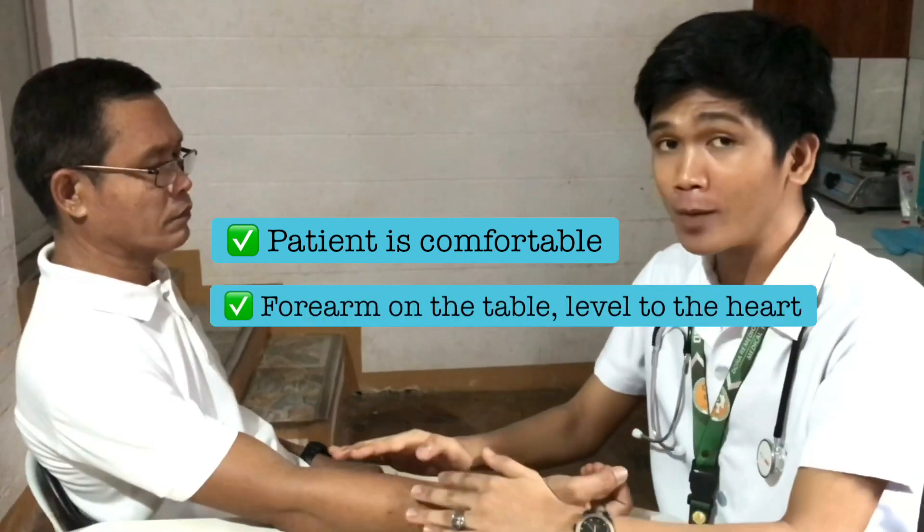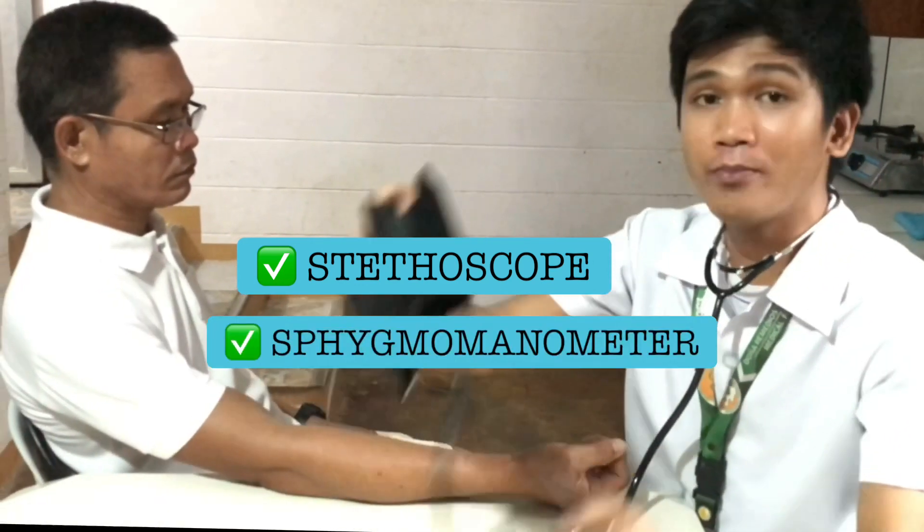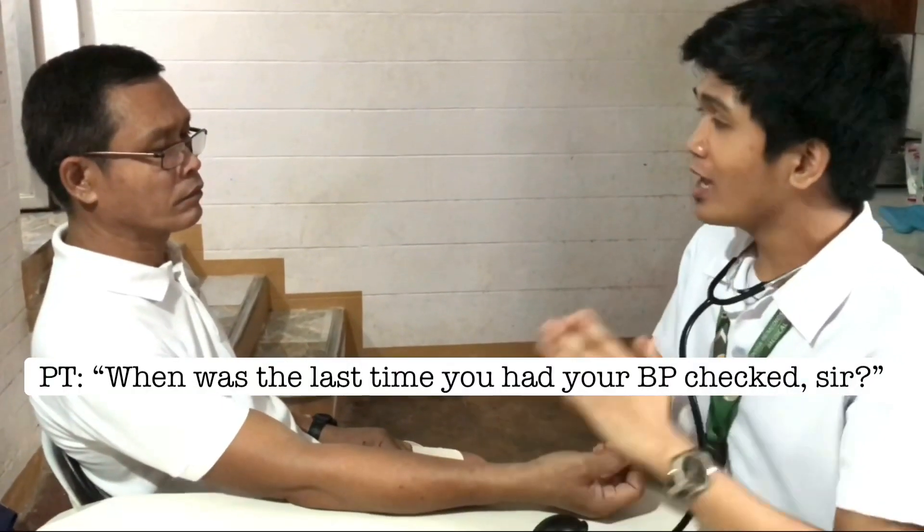And lastly, step number ten: get the blood pressure. First, make sure the patient is sitting comfortably with the forearm on the table at the level of the heart. We need a stethoscope and a sphygmomanometer. We should ask the patient questions like: 'When was your last blood pressure check?' — six months ago. 'What was your blood pressure then?' We need those answers because they will serve as our baseline for comparison with the current reading.